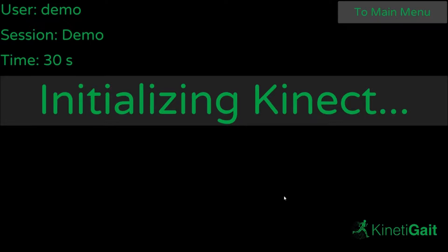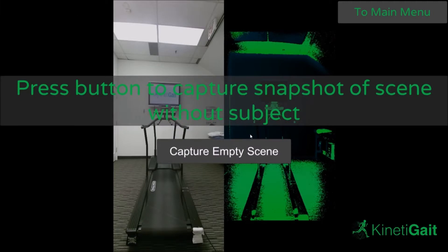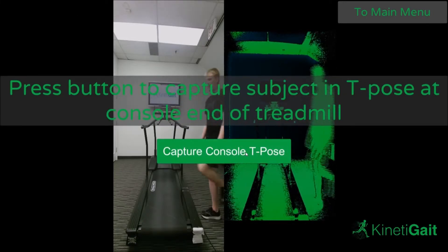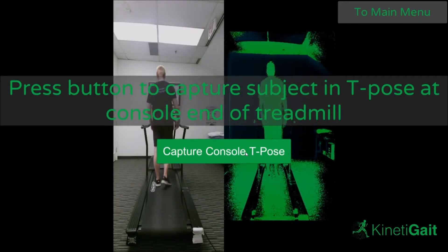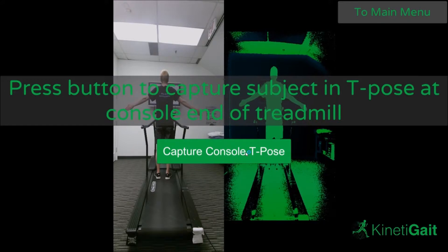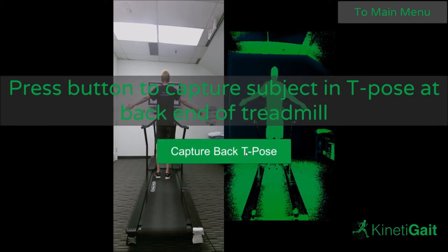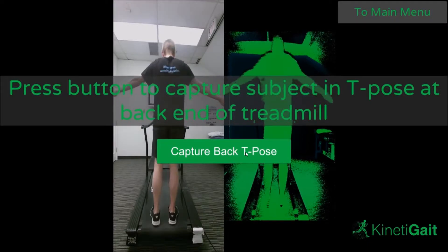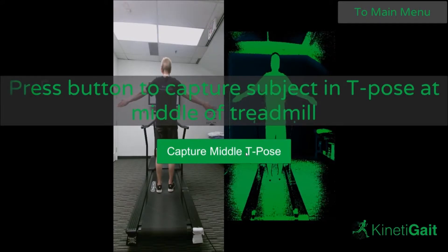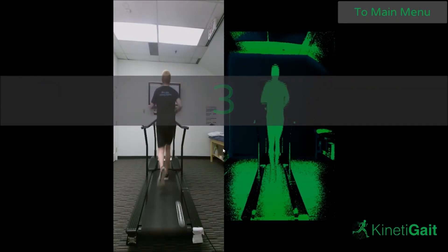The next step involves a quick calibration procedure. First, capture the empty scene — a snapshot of the treadmill and room without the subject in view. Next, have your subject stand towards the front of the treadmill with their arms outstretched at 45 degrees with their palms facing forward. Repeat this procedure with your subject standing at the back of the treadmill as well as the middle. Ensure at each stage their body is fully contained within the frame.